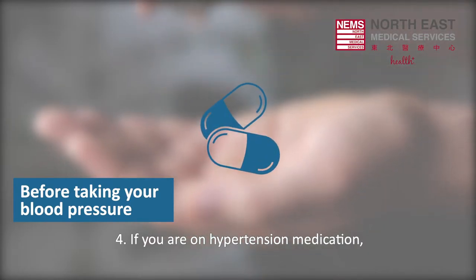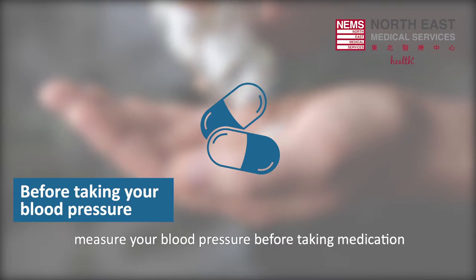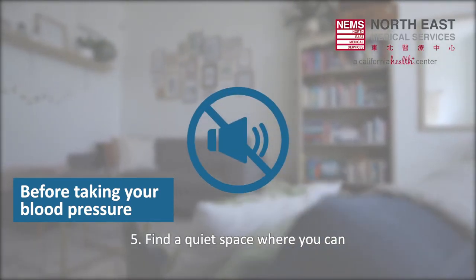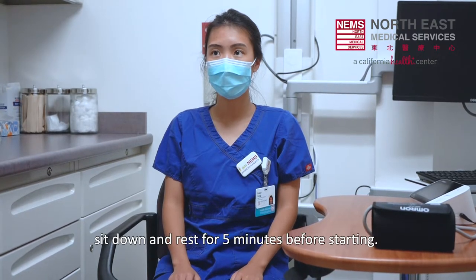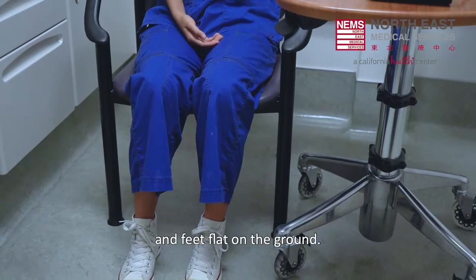4. If you are on hypertension medication, measure your blood pressure before taking medication. 5. Find a quiet place where you can sit comfortably without distraction. When you are ready to measure your blood pressure, sit down and rest for 5 minutes before starting. Keep your back supported and feet flat on the ground.